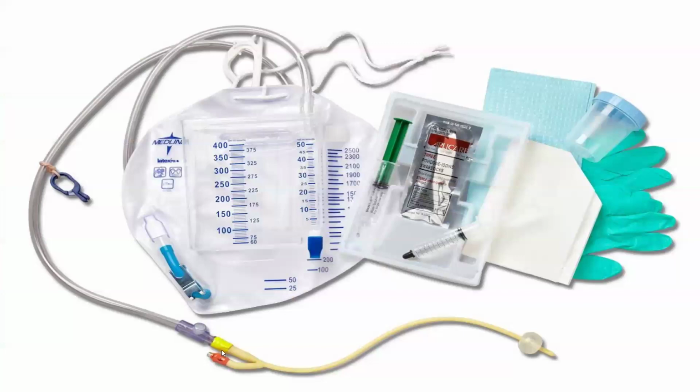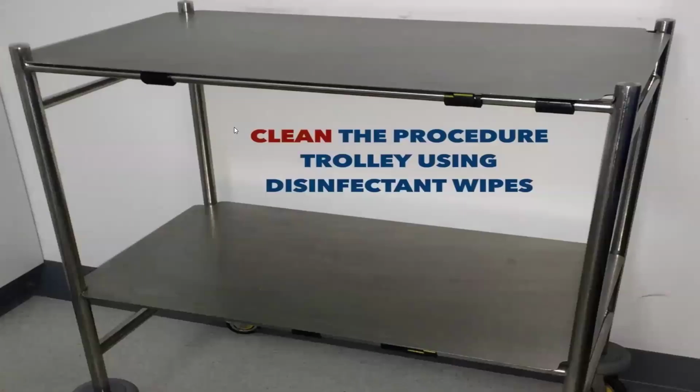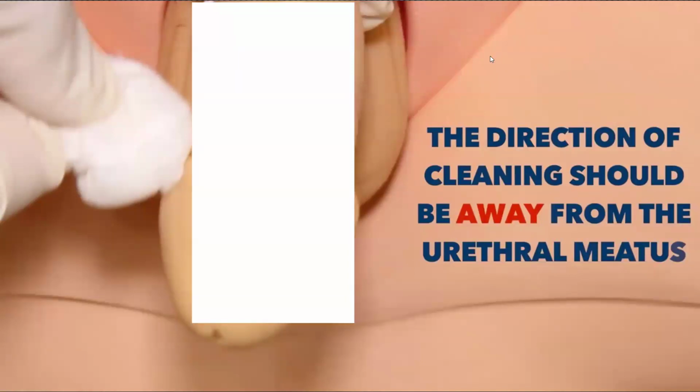Here, this one for drainage, you connect to the bag, and the colored one is to inflate the balloon. This three-way, the third one is for irrigation. Do you need two-way or three-way? Two-way is enough. If you want a three-way, no worries. I'm talking about the steps now. You will wash hands with PPE, and you will clean the urethral meatus.